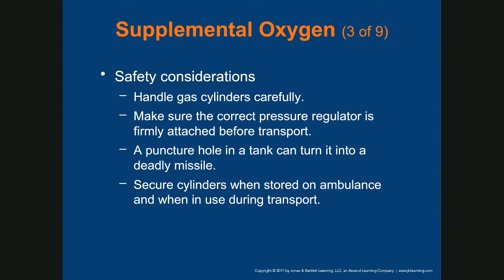Make sure the correct pressure regulator is firmly attached before transport. And how the regulators are designed, it's very difficult to attach the wrong regulator to an oxygen cylinder because it uses a pin indexing system, right? So there are pins on the regulator that can only line up on the cylinder.